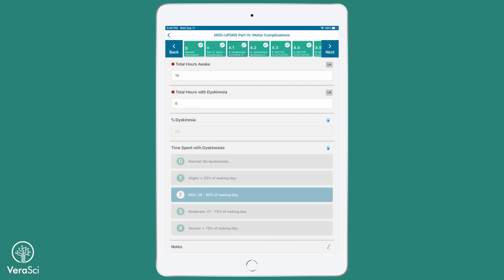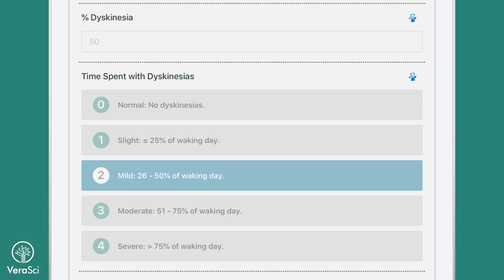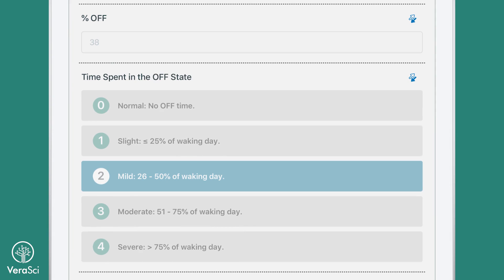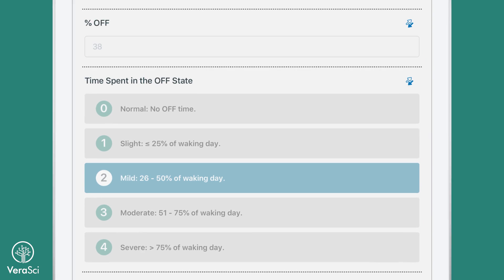When the clinician correctly completes these fields, Pathway will automatically calculate the percentage of time the patient experiences each motor complication during these waking hours.